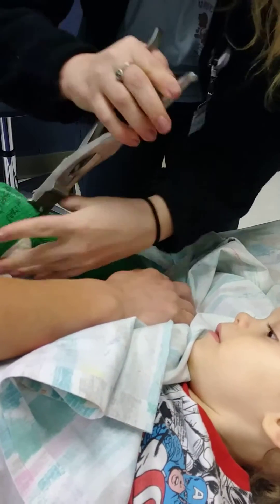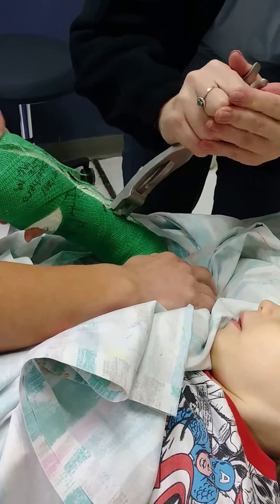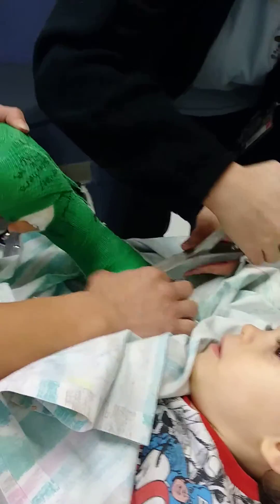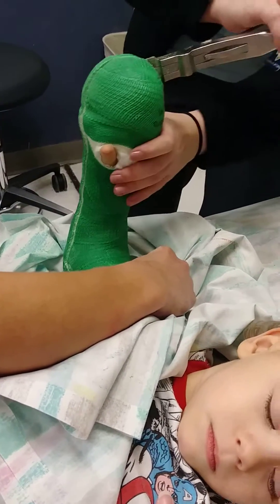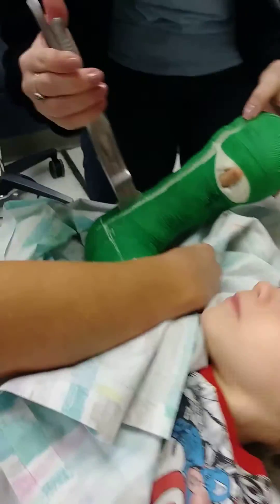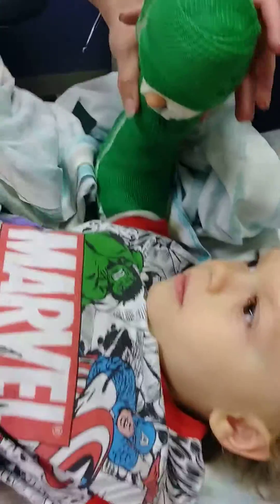Oh my god. You said you had a cast, right dad? Wow. You okay? Getting it in your eyes? Yeah, you're okay. That'll get the dust out.